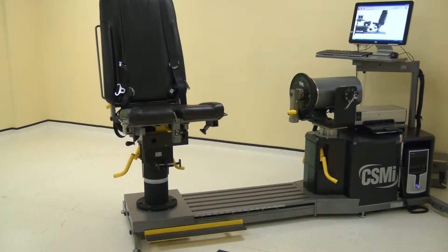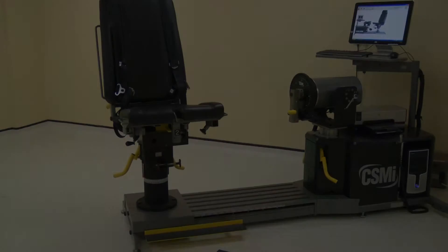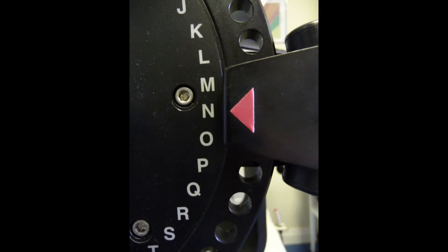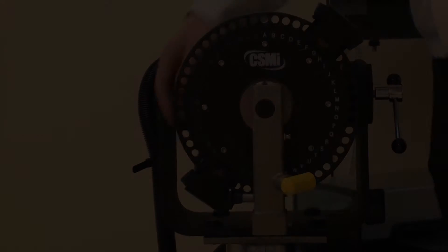To position the machine, first ensure all of the adapters and stabilizers are removed. Move the first dynamometer stop to position N on the white scale. Now move the second stop to position N on the green scale.